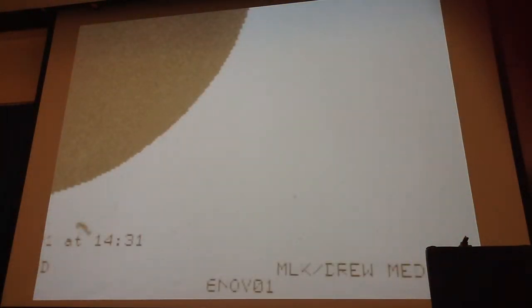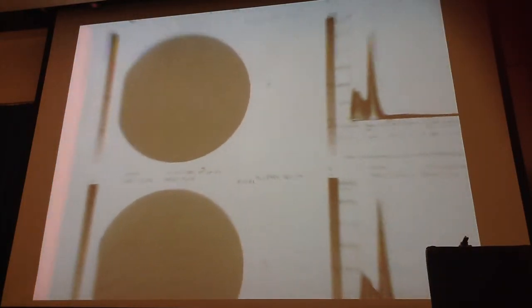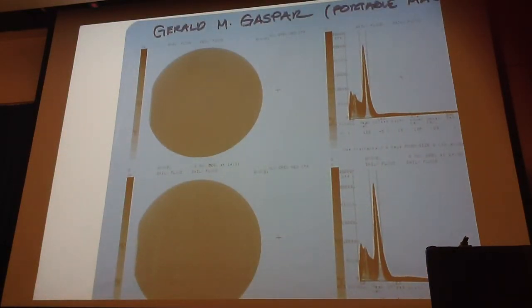But going back to our story, the next thing we do is a uniformity flood, and again, you should be able to determine whether you're doing an intrinsic or extrinsic. So how do you guys like that one? Are you going to go ahead and use the camera?